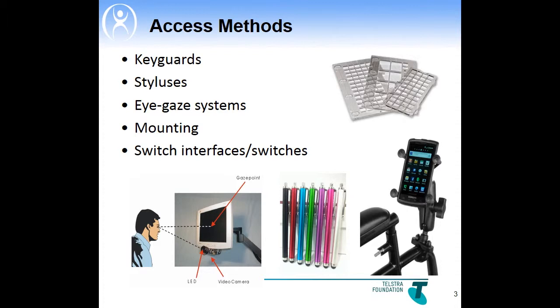Latching mechanisms are provided for keys, such as Shift and Control, to hold the keys down while pressing another key. Key guards must be custom-made to suit the app or layout. For example, there's an iPad keyboard in landscape or portrait or for specific apps.